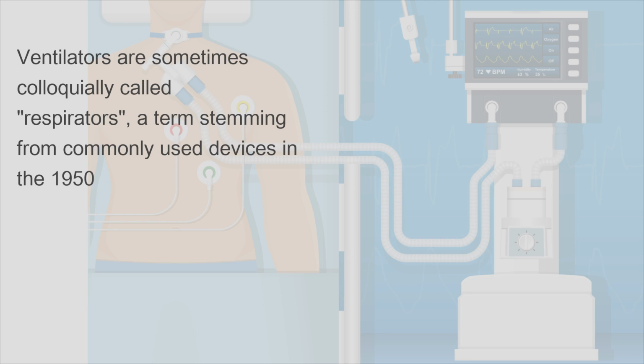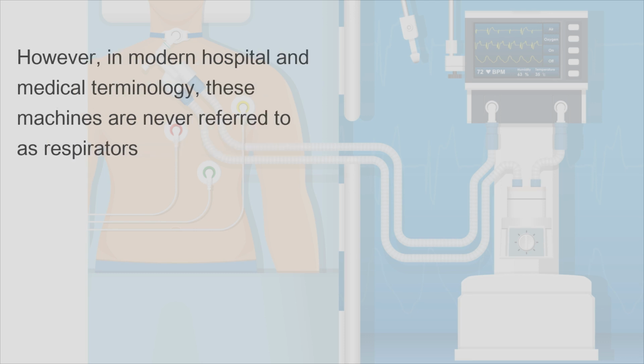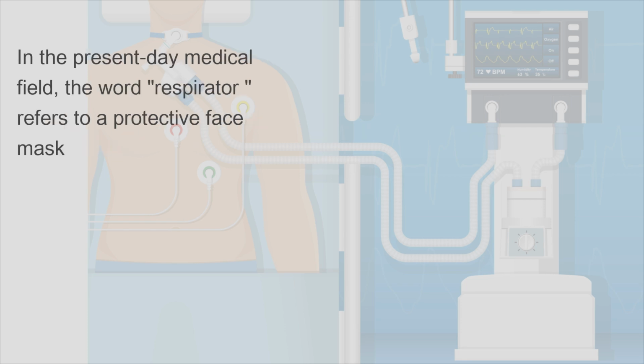Ventilators are sometimes colloquially called respirators, a term stemming from commonly used devices in the 1950s. However, in modern hospital and medical terminology, these machines are never referred to as respirators. In the present-day medical field, the word respirator refers to a protective face mask.